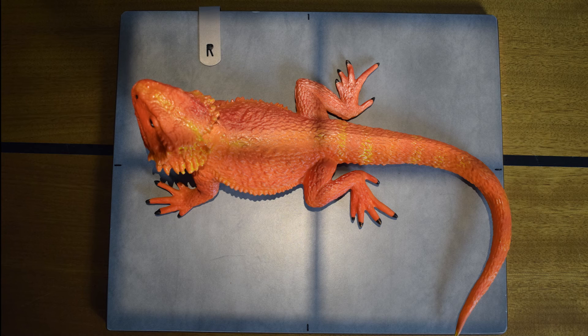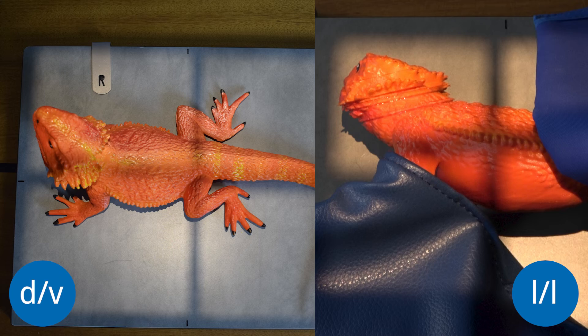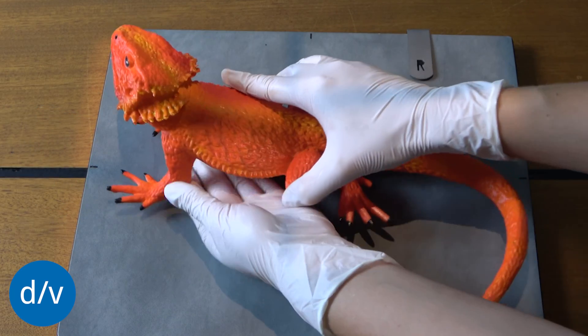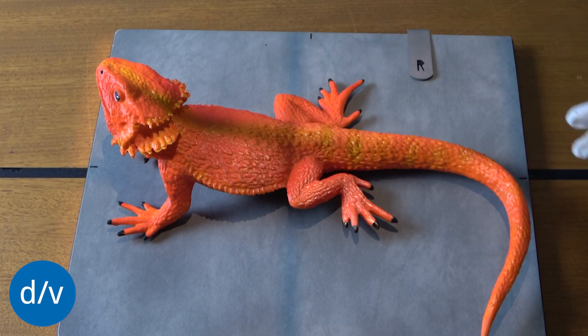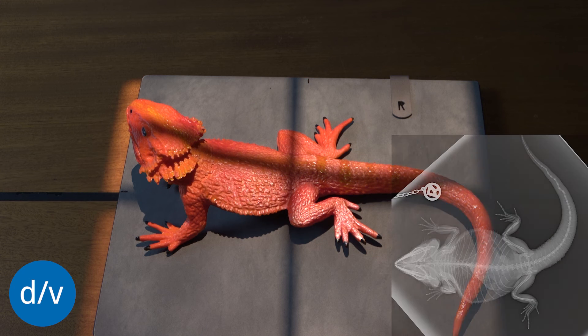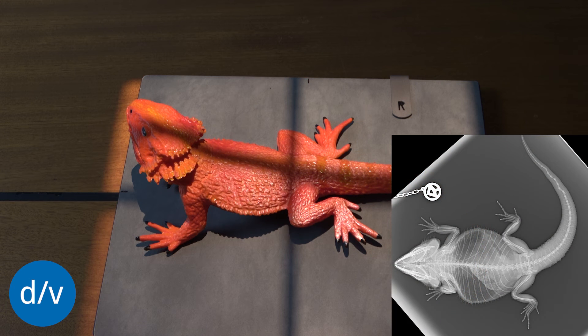For lizards, dorso-ventral and lateral-lateral are the standard projections. For the dorso-ventral image, the animal is placed on the plate in a physiological position and, if possible, the image is taken without manual fixation. If fixation is necessary, the hind limbs are fixated at the base of the tail with one hand and the forelimbs and neck are fixated with the other.